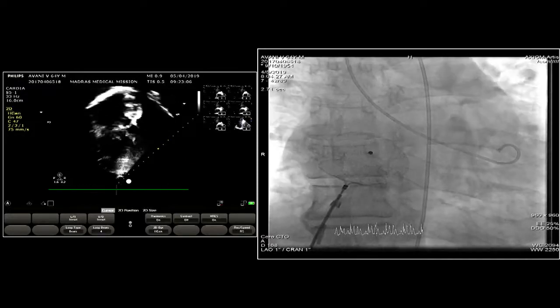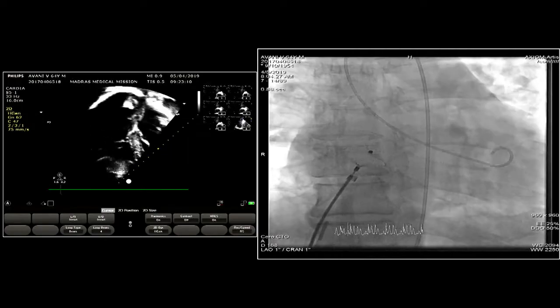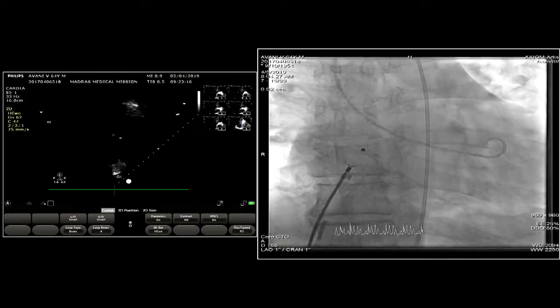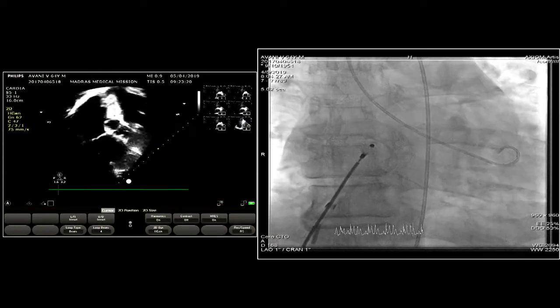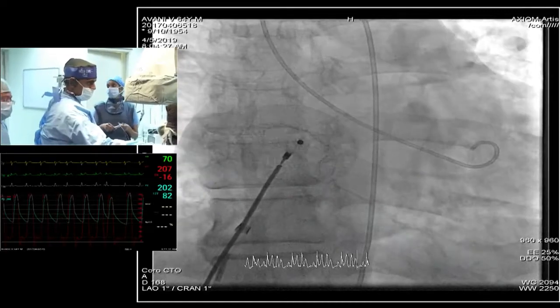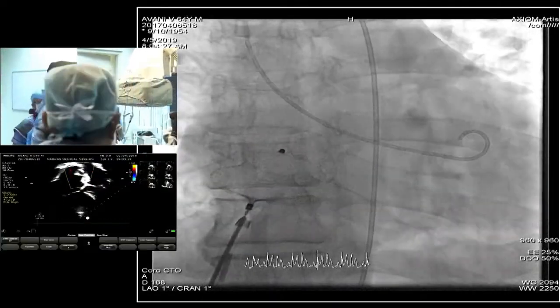Dr. Sivakumar, when you are closing this, if you find some of the margins have got fairly flimsy borders, in those scenarios, do you go with the ICE imaging sizing or would you use balloon sizing? That's kind of where I find that balloon sizing becomes useful. I agree, because it gets much bigger than what we expect on an echo. Yeah, we stopped balloon sizing about 12 to 13 years ago.